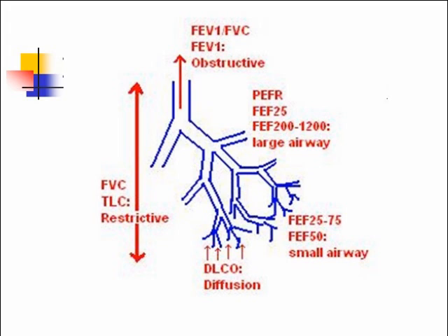It's not the bottom of the lungs, but it's the farthest reach into the alveoli to the alveolar membrane. That diffusion is measured or identified if there's a problem. Now, on the left side, you can see that if the lung volume is larger or smaller, that'll be detected by the FVC and the TLC.